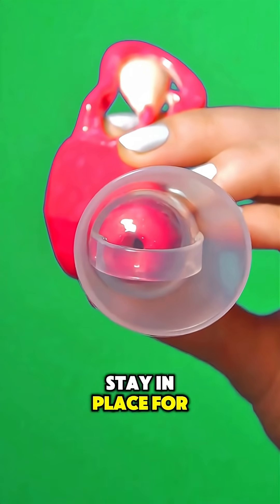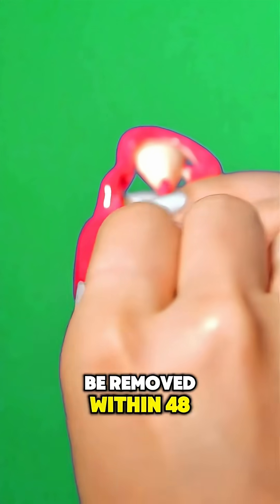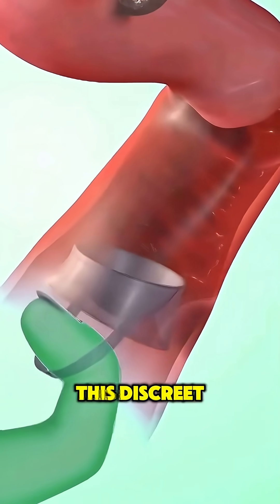The cap needs to stay in place for at least 6 hours after intimacy and should be removed within 48 hours. It's simple, reusable, and hormone-free. Ever considered using something this discreet and effective?